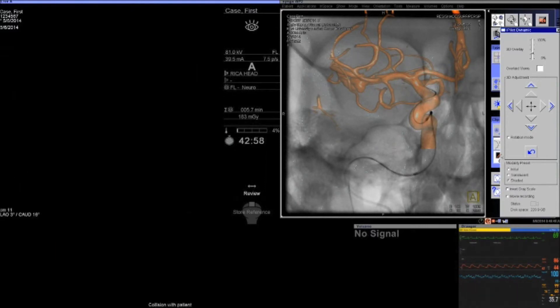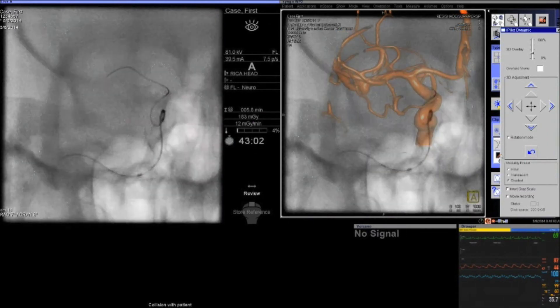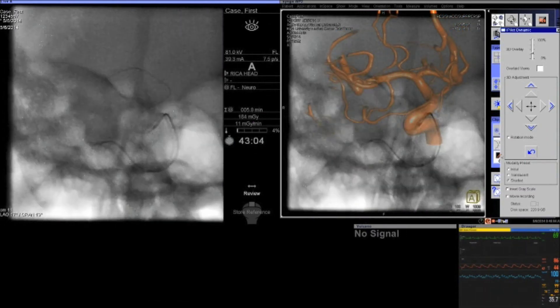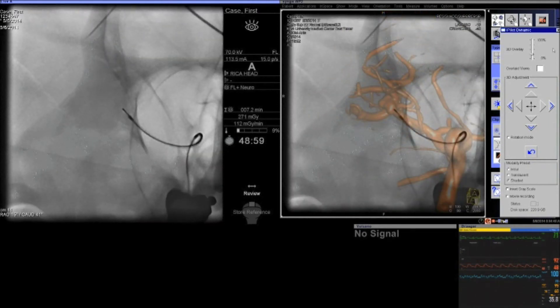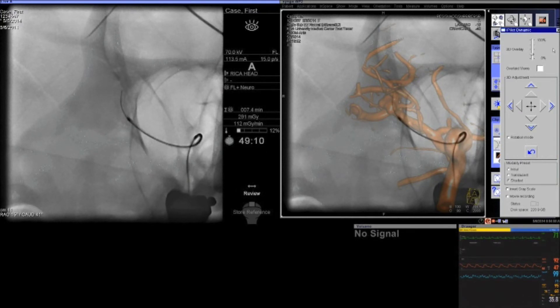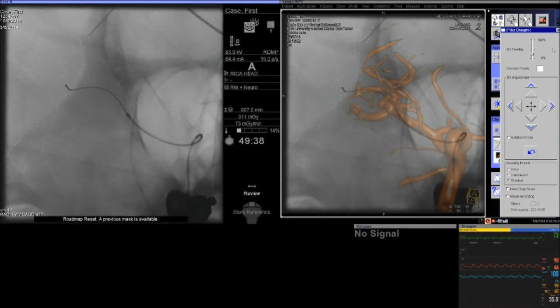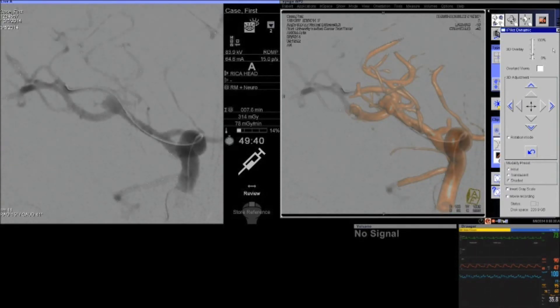Using the 3D roadmap technique allows us to have on the left side of our monitor a fluoroscopic view and a better appreciation of device performance through the anatomy. On the right side, you can choose the angle of the anatomy without having to do a constant number of roadmaps as you navigate this very challenging anatomy. Having the 3D roadmap gives you a lot of flexibility.